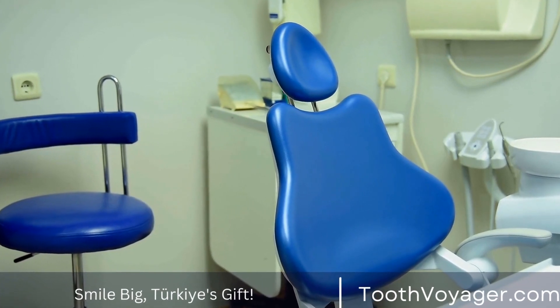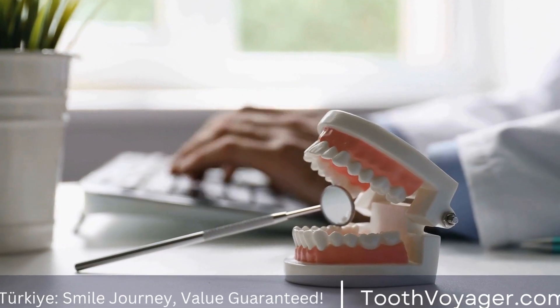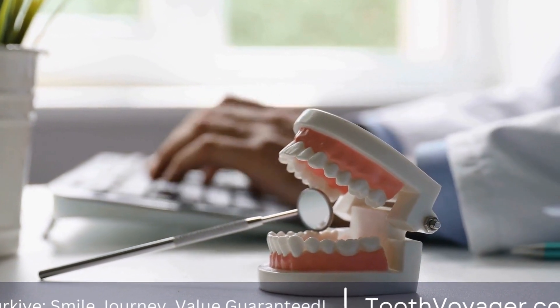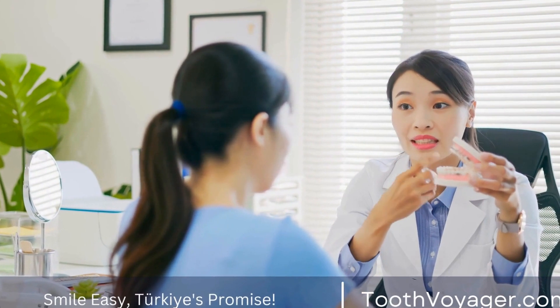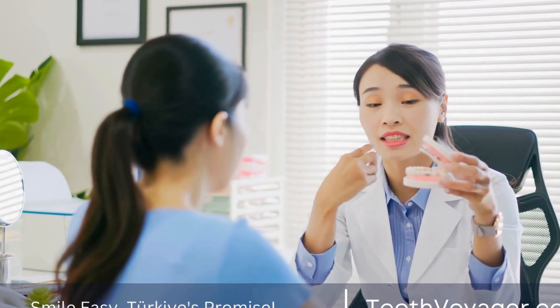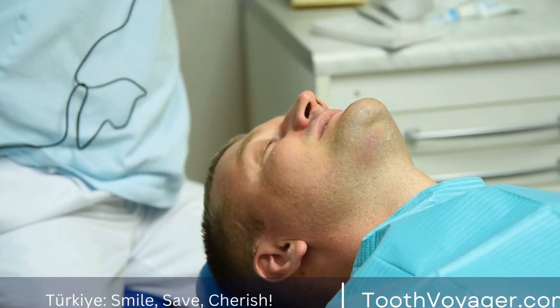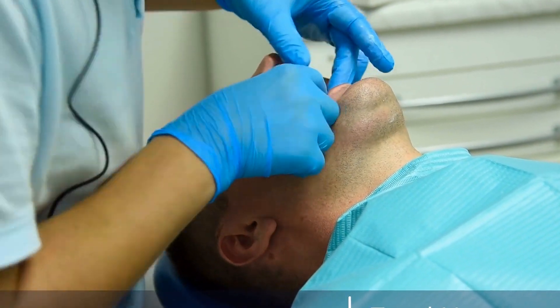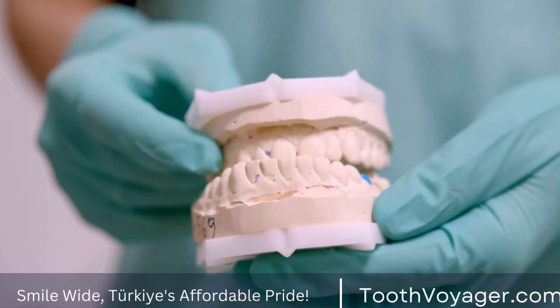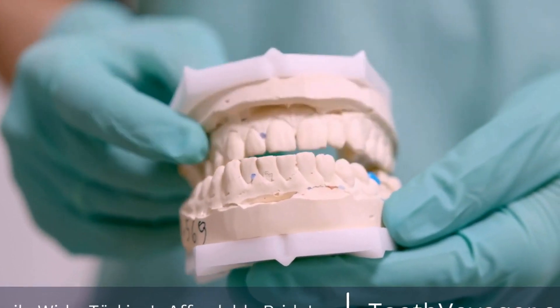Step 4 – Final Restoration. The final step in the implant dentistry process is the placement of the final restoration. This may be a crown, bridge, or denture, depending on the number of missing teeth and the treatment plan established during the initial consultation. Your dentist will take impressions of your mouth to create a custom restoration that fits perfectly with your existing teeth. The restoration will be attached to the implant, providing a natural-looking and functional replacement for the missing tooth or teeth.